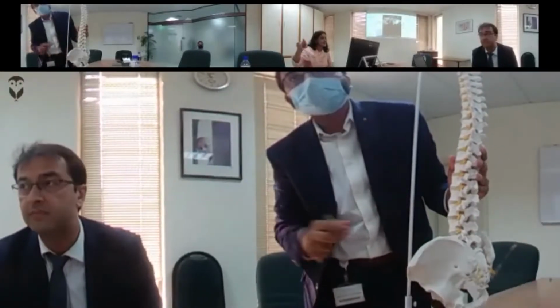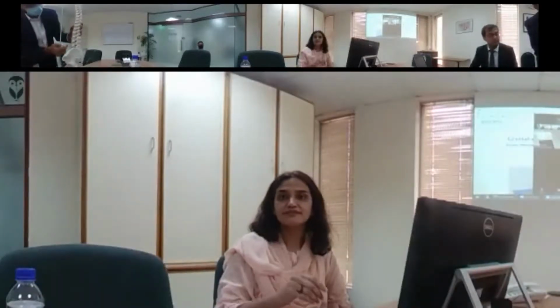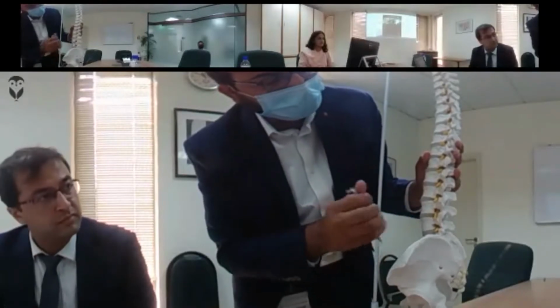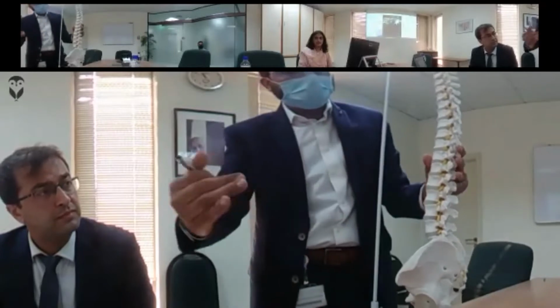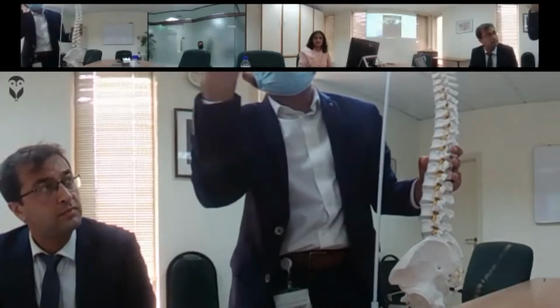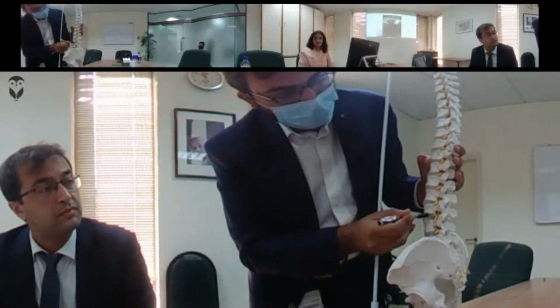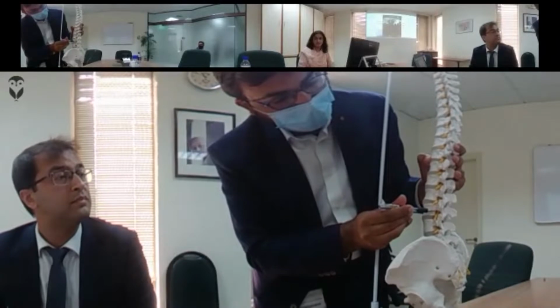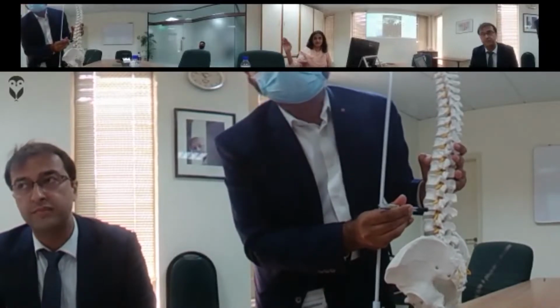So can you demonstrate again, because the video just shifted onto you now? Yeah. So see here, for example, that's L5, L4, and that's L3. Just for the purpose of demonstration, I'm taking L3. So I am taking a lateral image there. On the screen, you will see the foramen, we can see here. So your needle is coming like this from here. So what they say is keep it in the upper one third and outer one third.